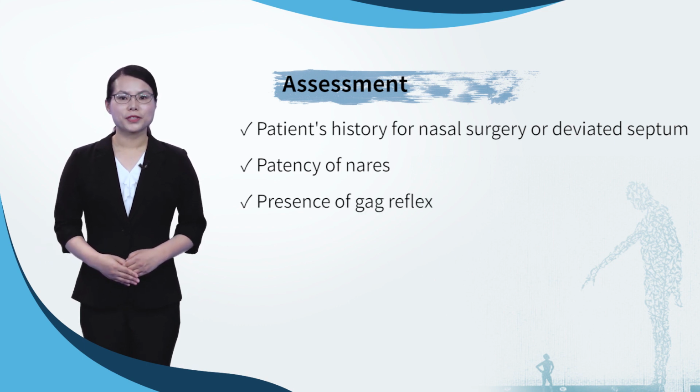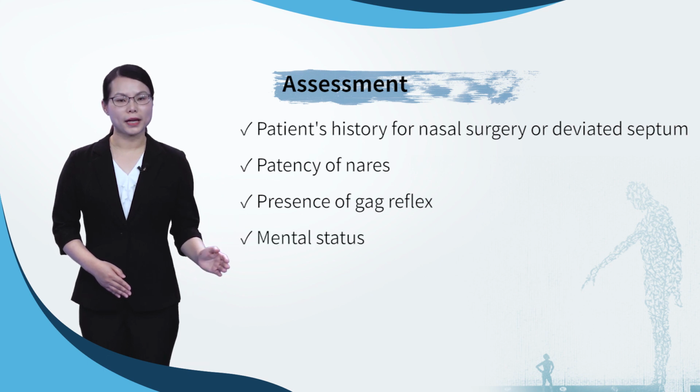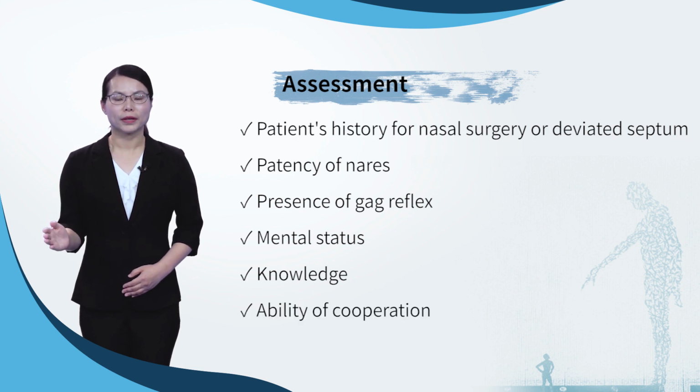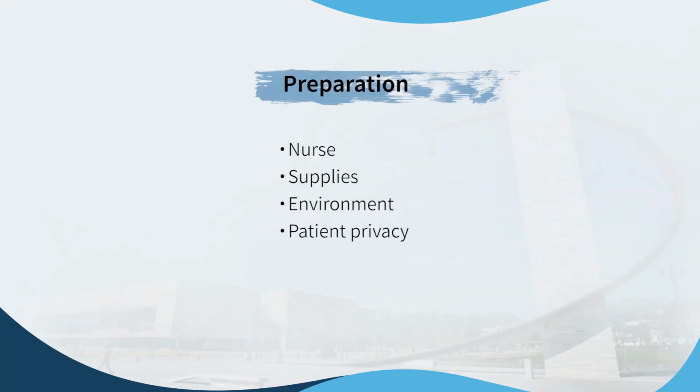It is necessary to determine the presence of gag reflex, assess the patient's mental status, knowledge about this procedure, and the ability to cooperate with the procedure. Basically, the nurse, supplies, and environment should be well prepared. It is necessary to ensure patient privacy.